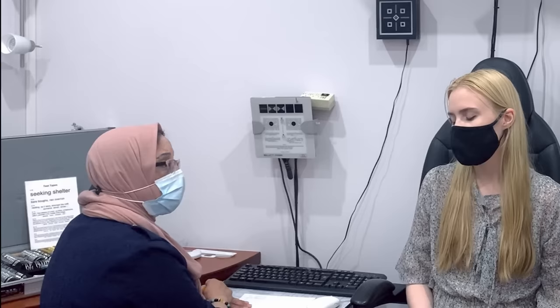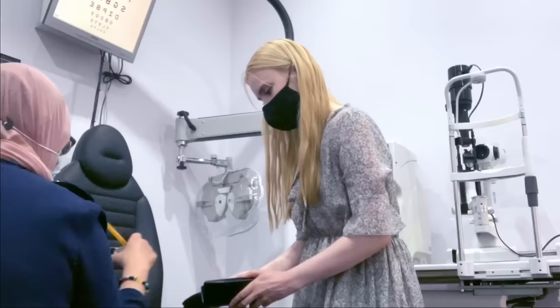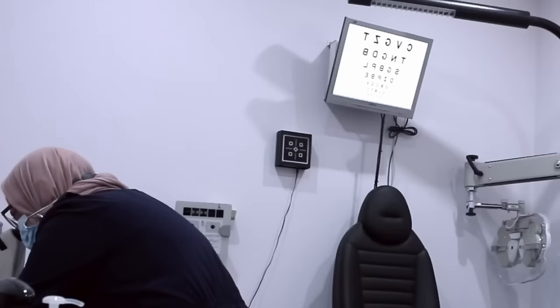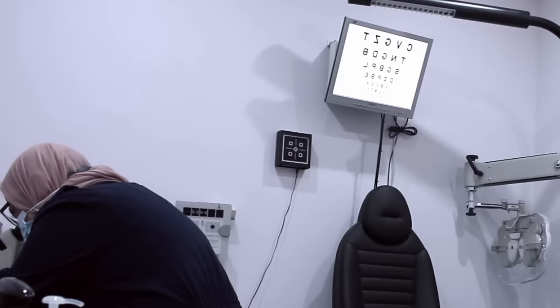And were you getting the headaches then? Yeah. And what did they say about that then? The headaches, I think it was more I wasn't using my glasses enough. But I don't wear them when I'm at the computer because I can see the computer quite fine. Okay, because they're mainly for distance. Have you got them with you? Let me just check them. Thank you. Oh, yeah, it's definitely a short-sighted prescription, isn't it? And it's not that strong.